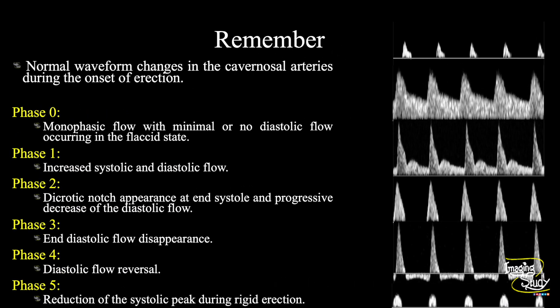The take-home message: the normal cavernosal artery waveform changes through 6 phases during erection. First, monophasic flow in the flaccid state with no diastolic component. Then increased diastolic flow. Then a notch appears at the end of systole. We observed almost all these waveforms in this case, but it stopped at phase 2. For normal rigid erection, the outflow of the emissary veins stops, end-diastolic flow disappears and then reverses, and finally the systolic peak reduces — none of which we saw here.